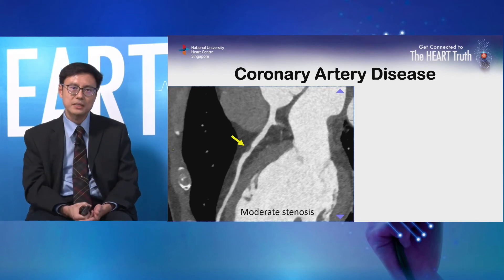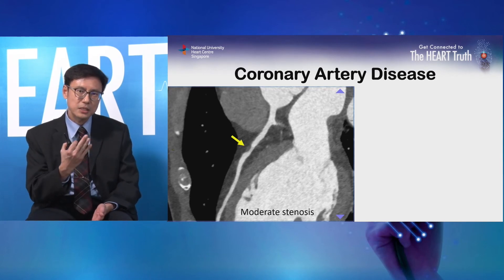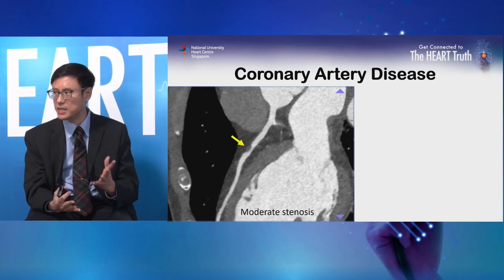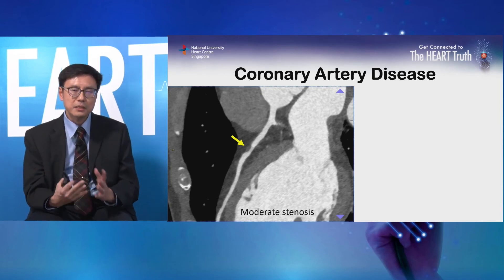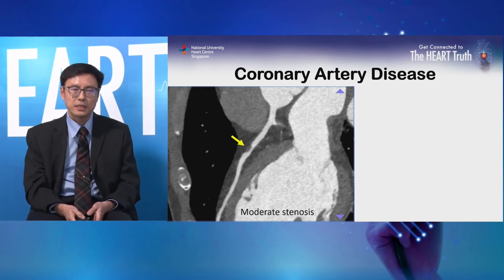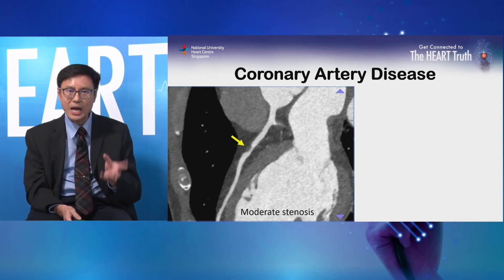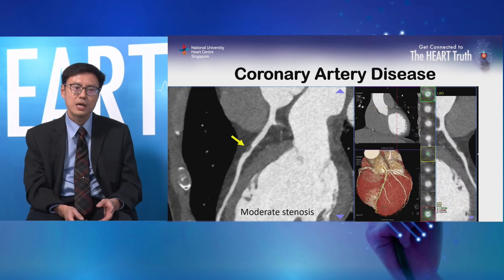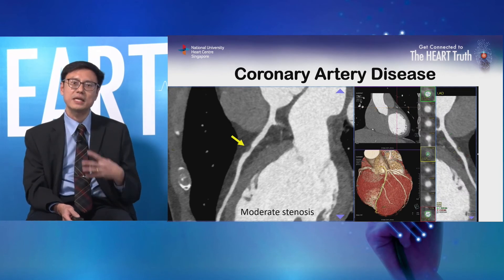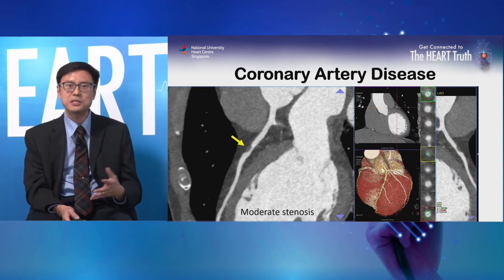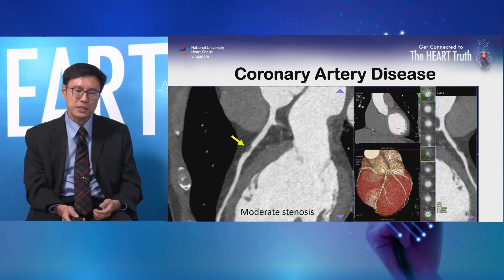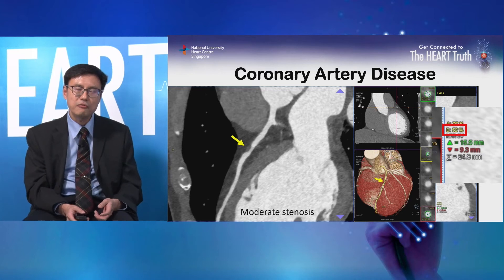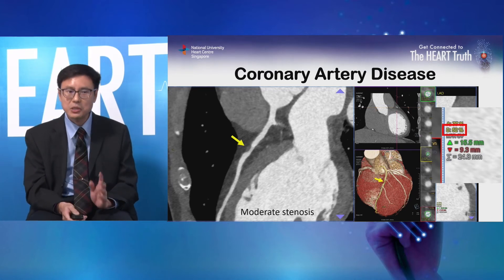Visually, the narrowing in that segment looks to be about 50%. Narrowing in medical terms is known as stenosis, so we would call this moderate stenosis. We don't always rely on visual estimation — we have computer software that can calculate the amount of stenosis. In this particular patient, the computer gave a value of 52%, which is quite close to our visual estimation.